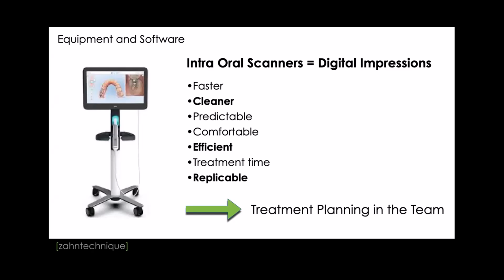We can send a scan, right? I mean, you know that too. We can send a scan. We don't have to send a courier to pick something up. And in my experience, all digital workflows are replicable. It means I have something saved, a design or a scan, and I can replicate that specific design over and over and over for that specific patient. Especially in removable, I think it's a really big win.